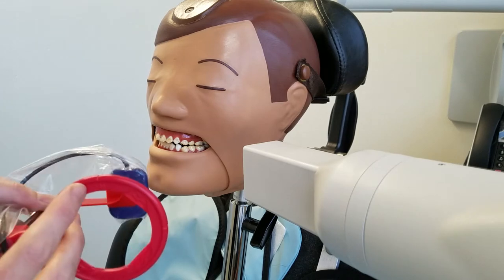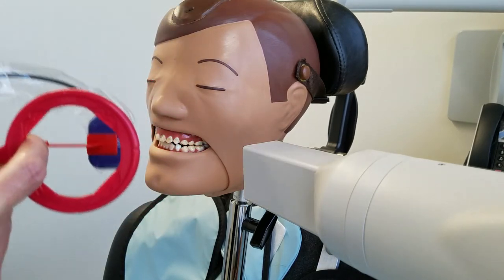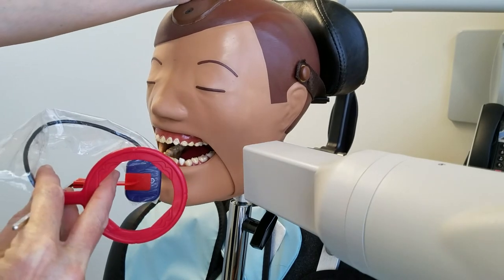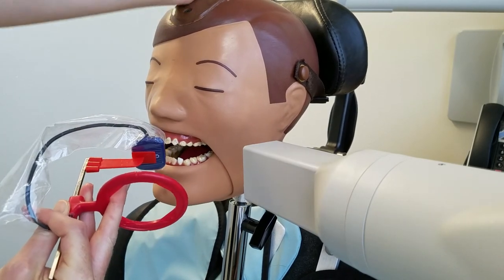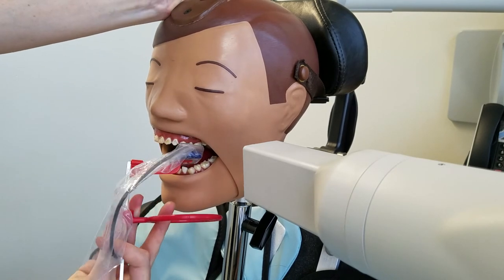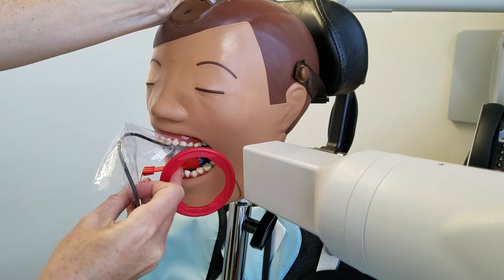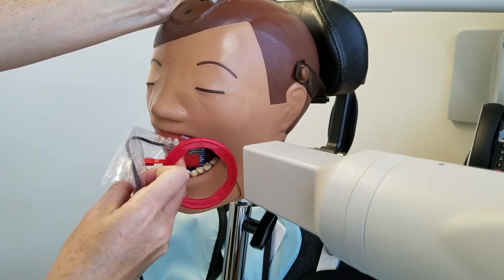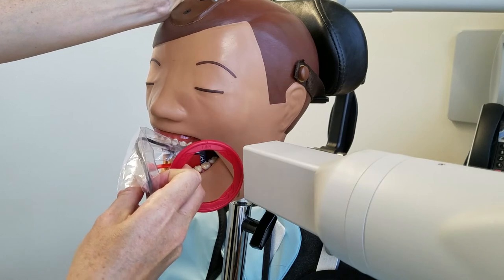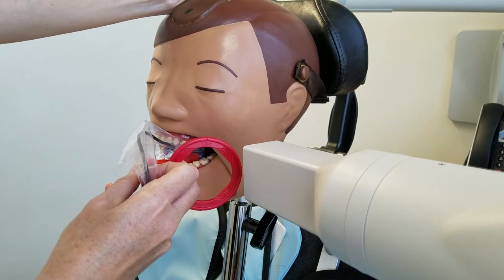There are lots of different schools of thought, but I think it's best to start in the anterior and go for the most anterior shot first — what would be the premolar shot. We want to make sure that we get the distal of the canine. So just come as anterior as you can, making sure that you can see the distal of the canine is in the picture.